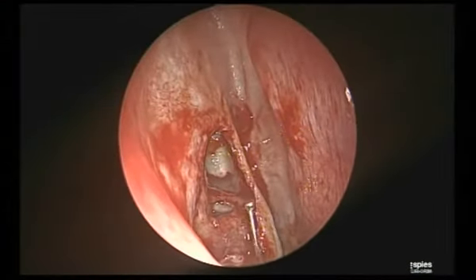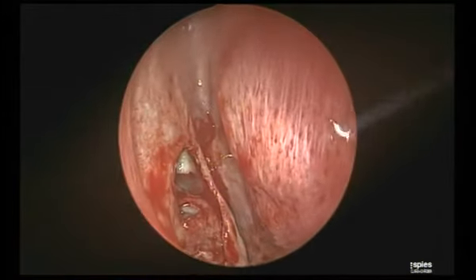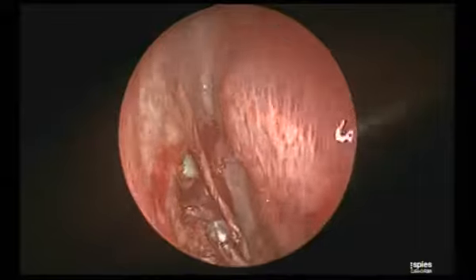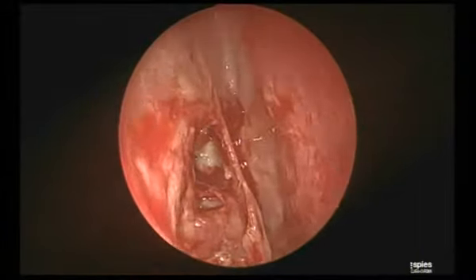Now see, this is my bulla. I am going into this hiatus semilunaris superioris. Again, this cleavage. You see, between the middle turbinate and the lateral wall of the bulla, the medial wall of the bulla. See this cleavage. So the secret here is to find that cleavage.